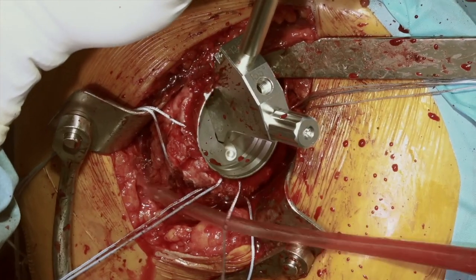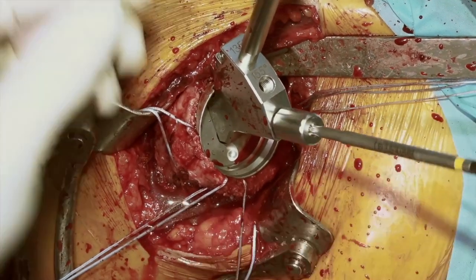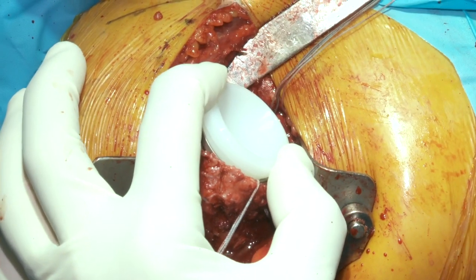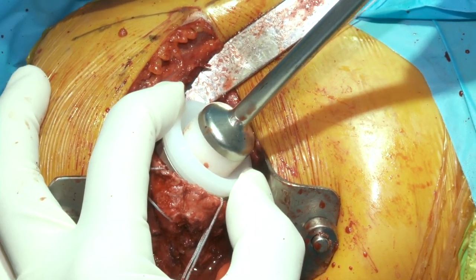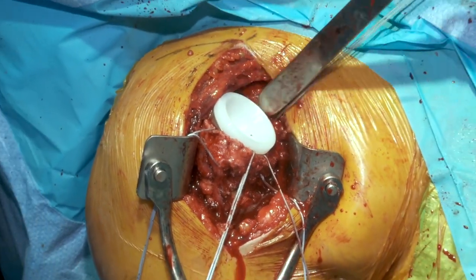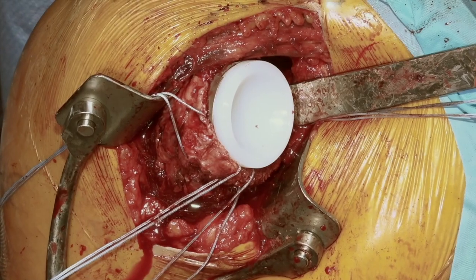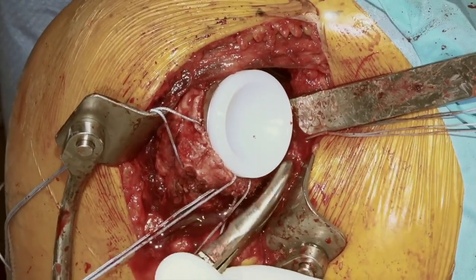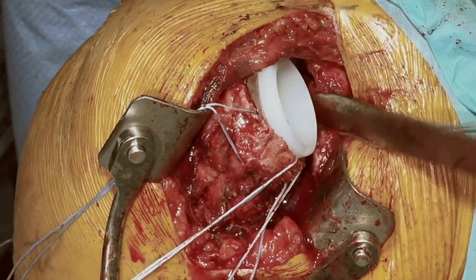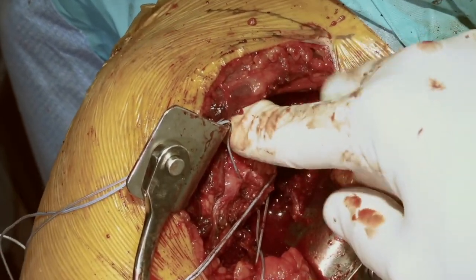We'll go down just a little bit further and place this into the center, then impact it into its final resting position. We'll check and make sure it's down all the way around — and it is. One final check to make sure no bone is going to impinge or strike. We'll clean off just a little bit more inferior and posterior to make sure it sits nicely with respect to the glenoid. Now that we've got our implant in place and seated nicely, we can take two fingers and drop this down into position. It will snap into place — we'll hear that sound.